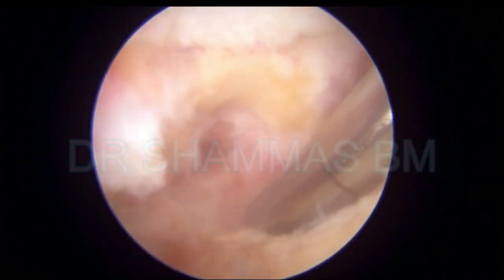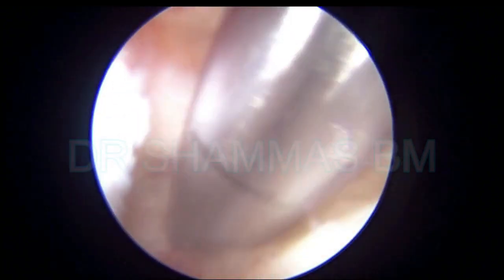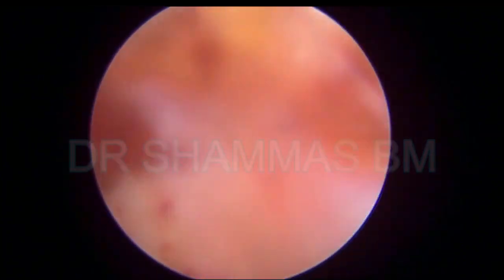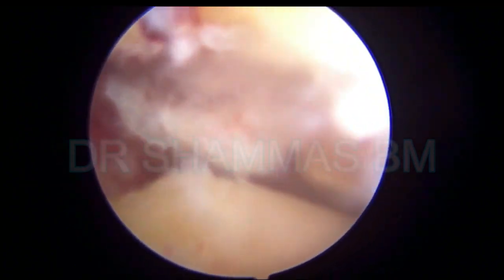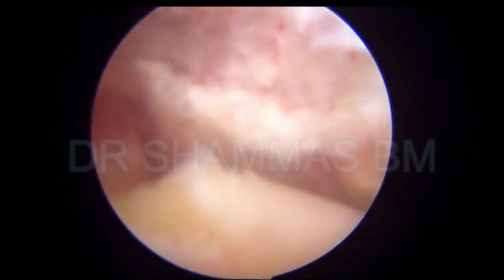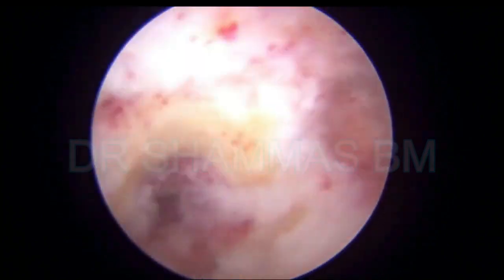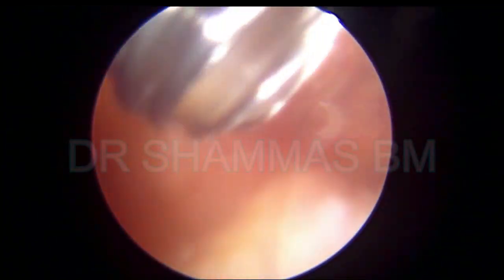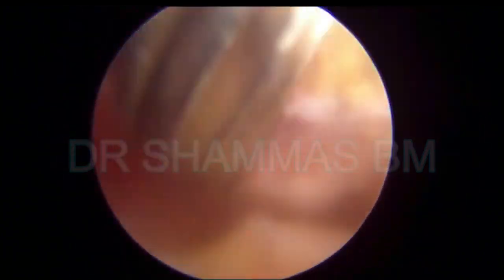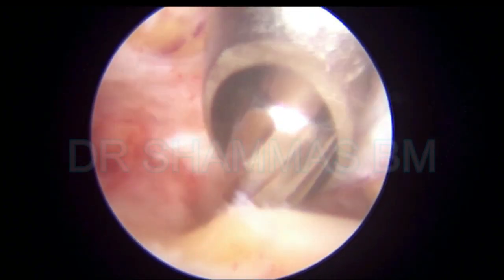The tourniquet is applied, which is why we have no bleeding or minimal bleeding — otherwise this will be a very bloody procedure. Now you can see that the joint is very well visualized. You can move the ankle joint and appreciate the movement inside. Here you see the medial side, then the lateral side, and this is the burr coming inside removing all the projections and soft tissues over the bone.